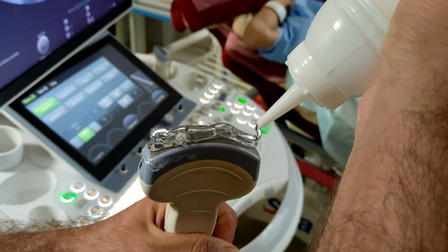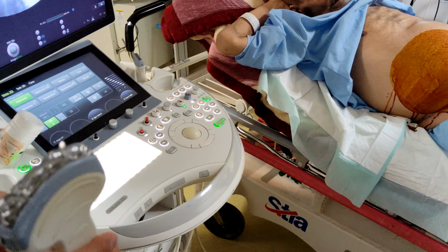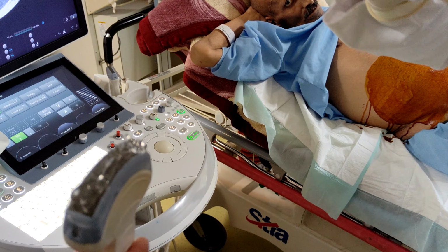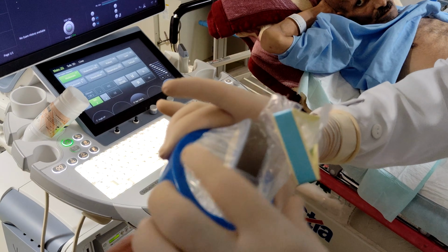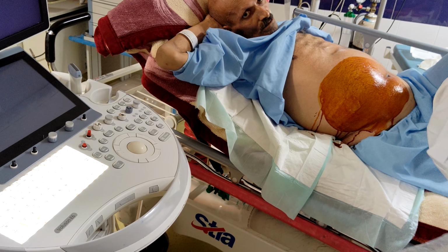to minimize complications. The key point during ultrasound assessment is to identify the largest and safest fluid pocket to avoid bowel loops, liver, spleen, bladder, and abdominal wall vessels.